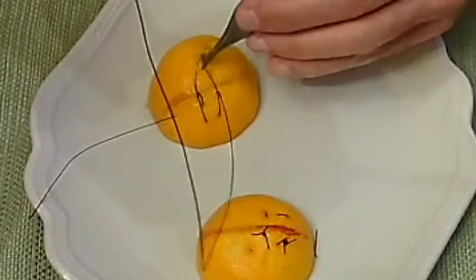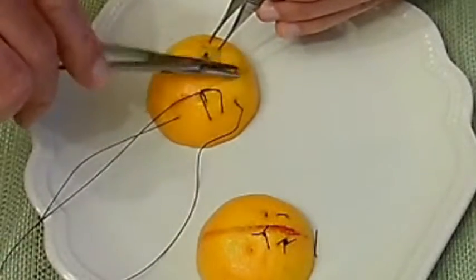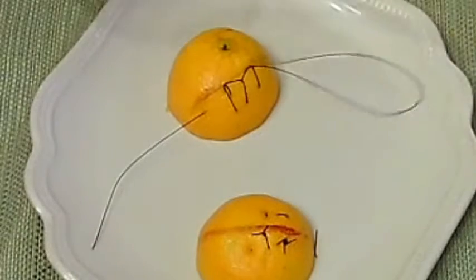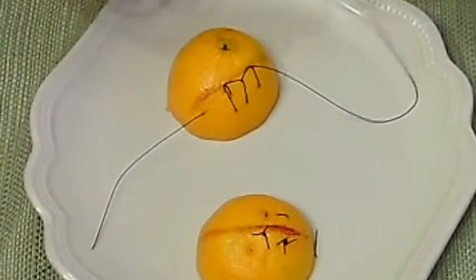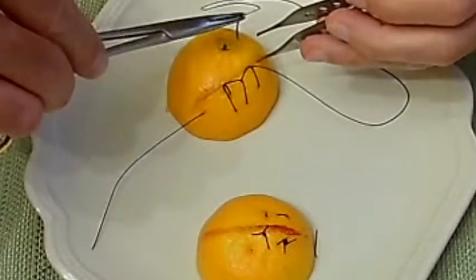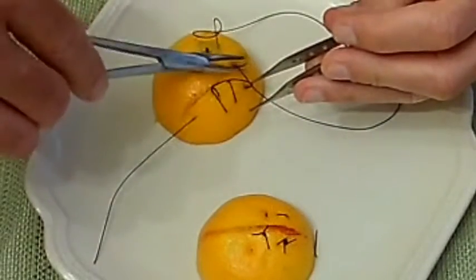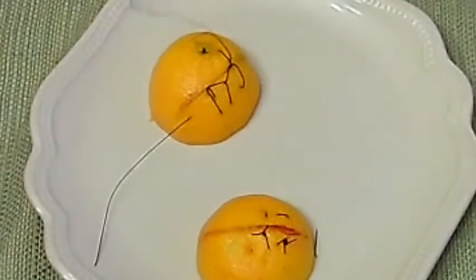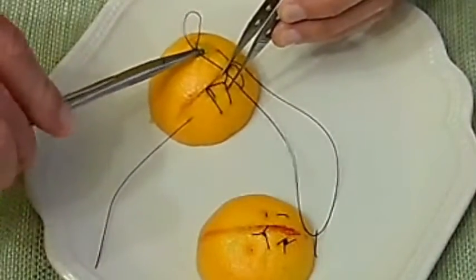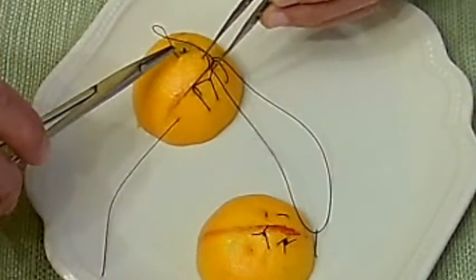You have another locking pass. You go back to the other side and go back down the way you came. The point is to have two suture limbs sticking out the end of the ruptured tendon — on the left of the screen in this case. Then you do the same thing in reverse on the other side of the torn tendon, tie them together in the middle, and the knot is buried in the substance of the tear so there's no external knot. That's good for gliding and rehabilitation of the tendon.